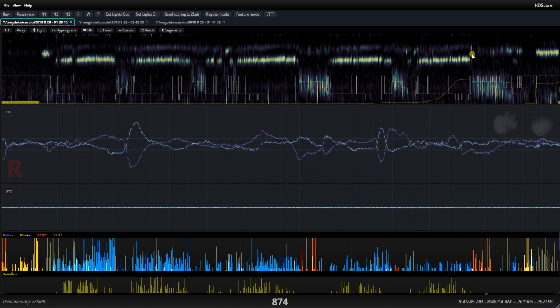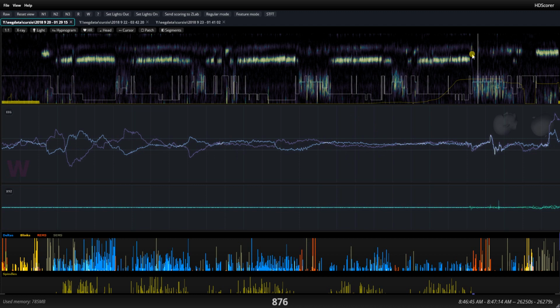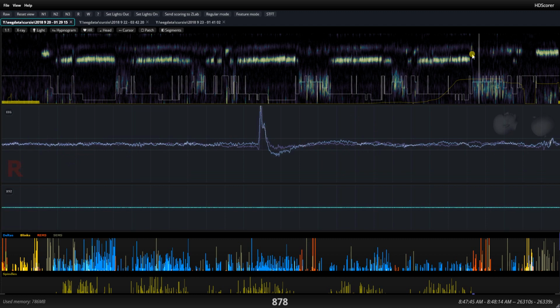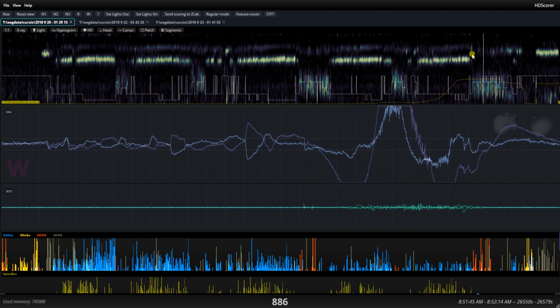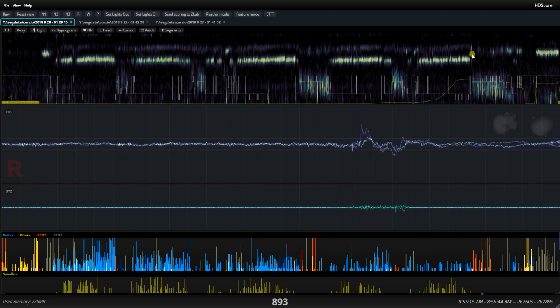If I want to be really, really precise with it, I think I would probably remove some of the epochs that got marked as wake. For example, here, I would say this is still REM. I would bypass that wake thing. It's perhaps a little bit too sensitive. And here there's a body movement, but the epoch begins with REM, so that's really a little bit too high detail for what the auto scoring does. Basically, if there's a big movement in the epoch, I call it wake. I would say a little bit more than half of the epoch is REM, but these things don't affect your results, so it really doesn't matter. If you output the sleep report in the end, this is not going to affect the metrics of your sleep or the sleep efficiency or the various breakdowns by much at all.